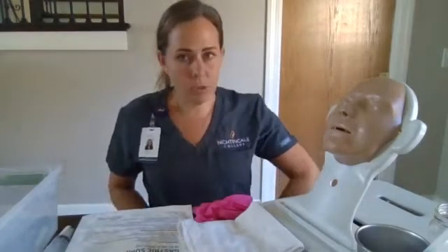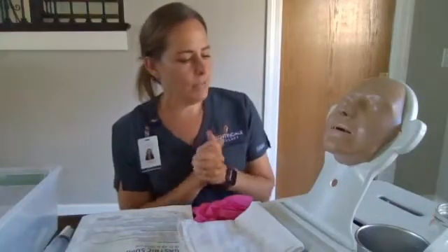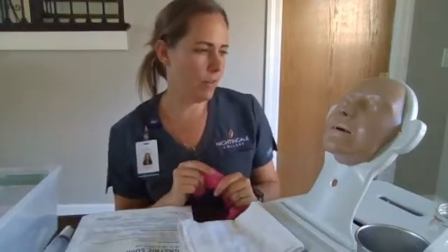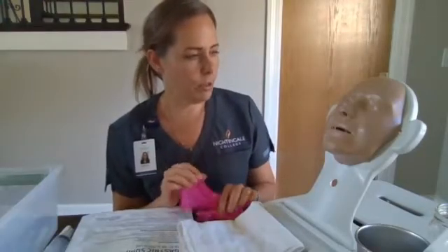We're going to enter our patient's room, close the door or curtain for privacy, perform hand hygiene. Hi sir, I'm Kim. I'm going to be your nurse today. Can you verify your full name and date of birth? Verify two patient identifiers.